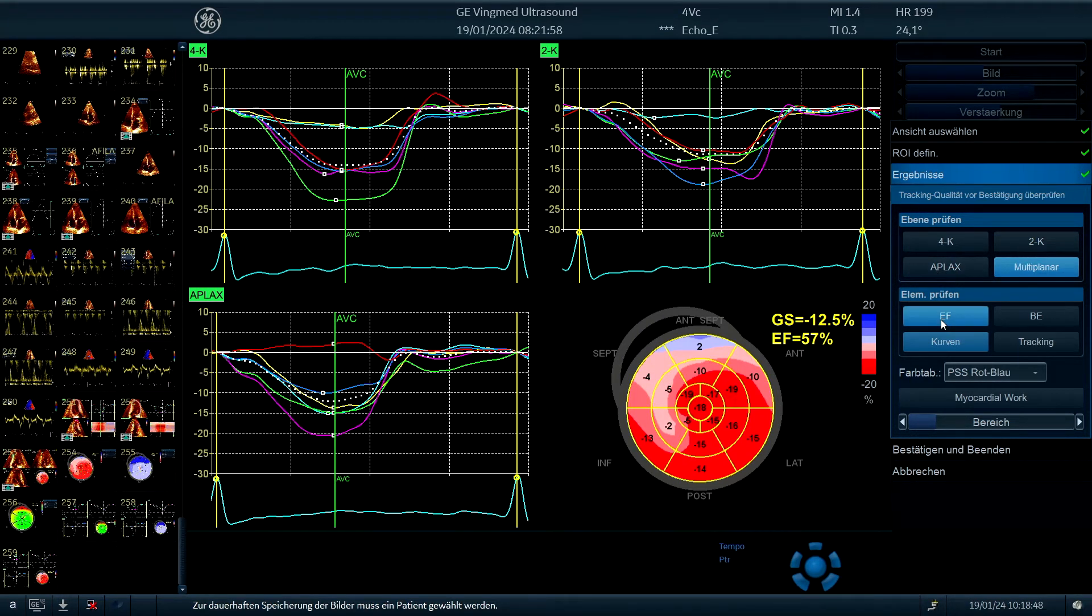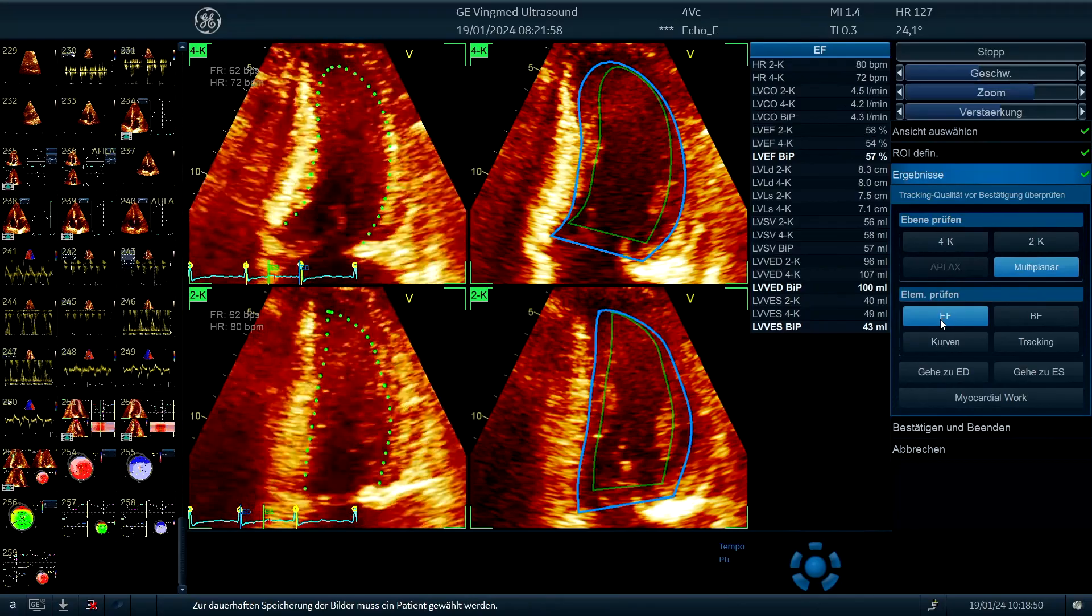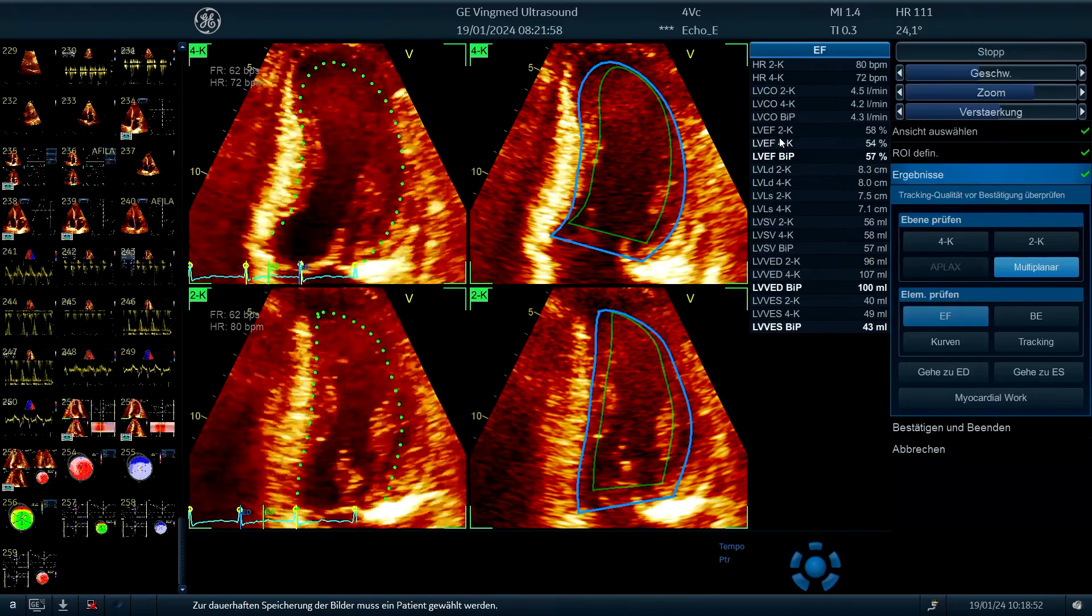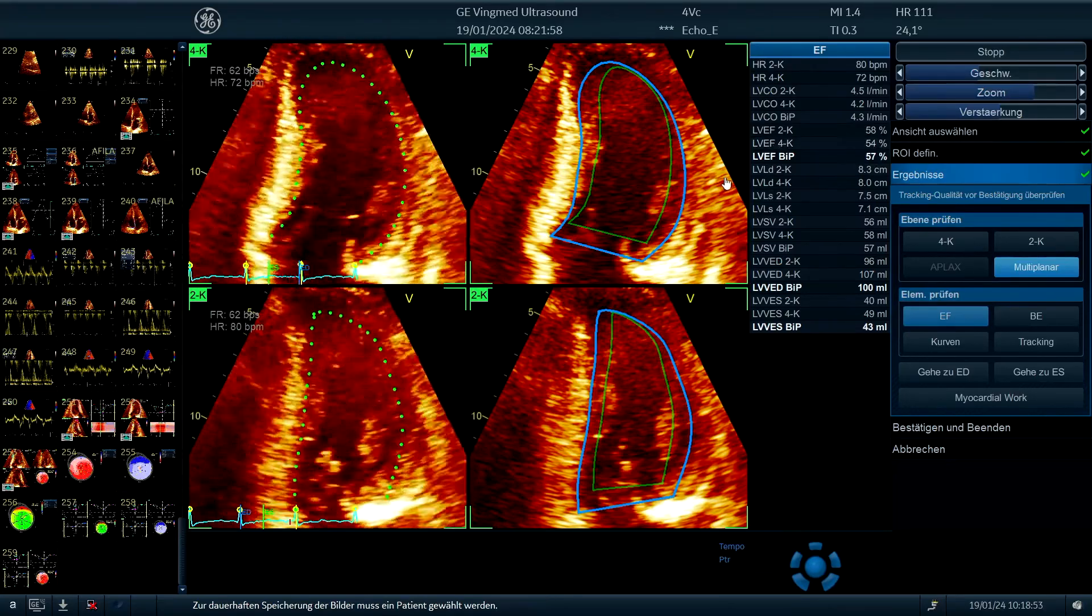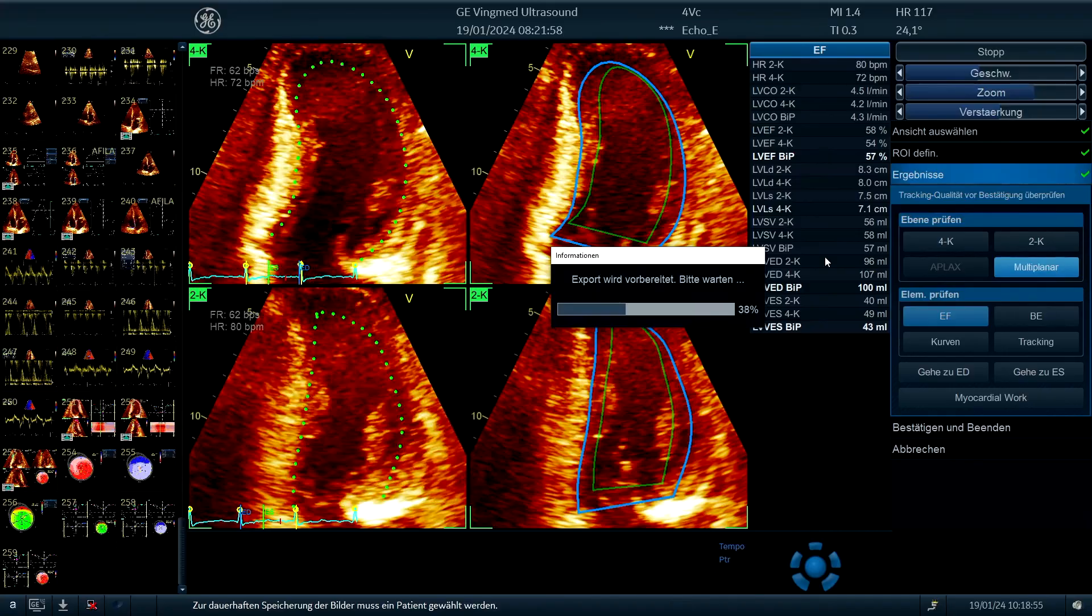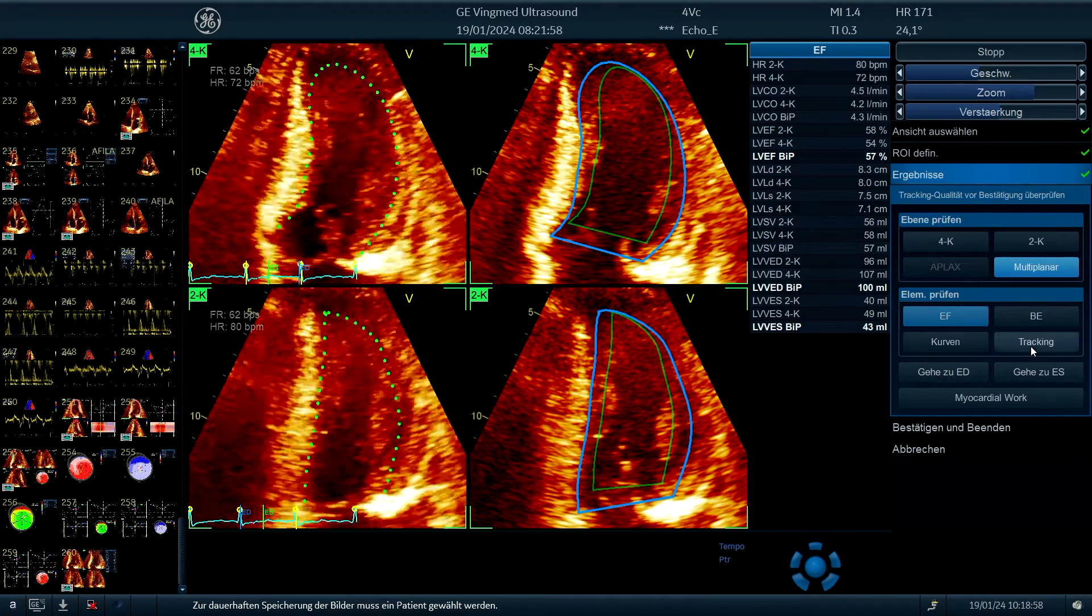We can also check ejection fraction, so here it is in the same range overall, probably a little bit underestimated, but that I can live with, so I'm quite happy with what we found.